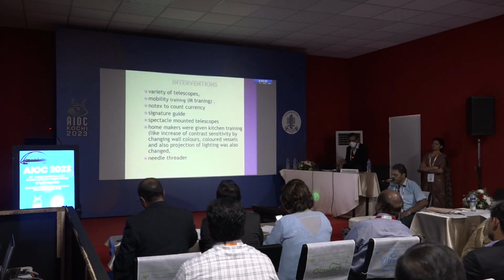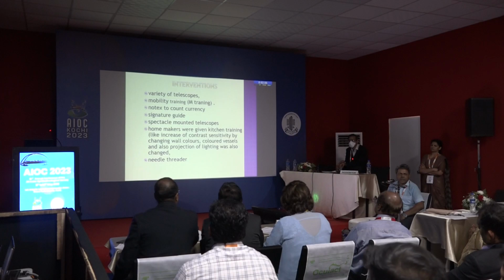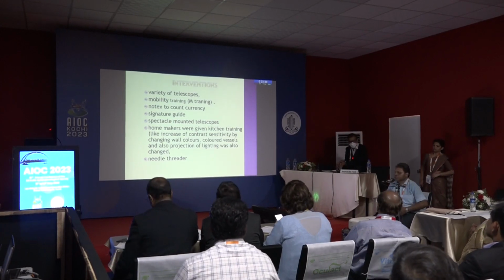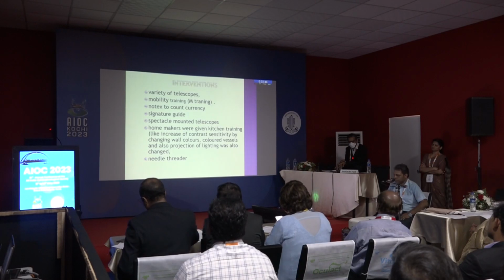Second thing I did was, I used to go to homes with my driver to help people with how they can make roti paratha and all. They can't make a roti with a one-hand magnifier. So I change their contrast and projection of light. Sometimes they have all colors also.